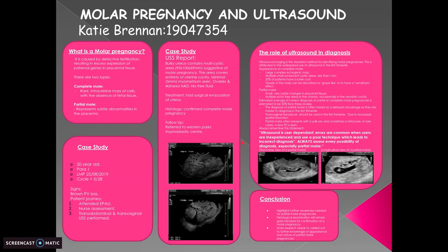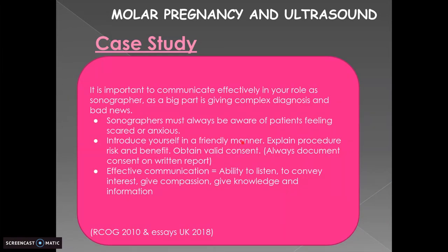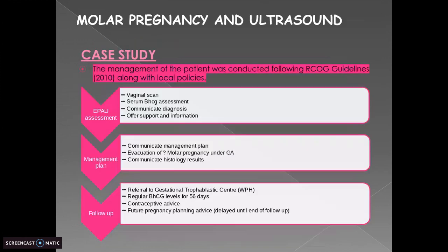The patient was given the diagnosis by the sonographer. A sonographer has the ability to give bad news in a way which is empathetic to the patient, whilst giving the facts of the findings, not using jargon that may confuse the patient. A nursing journal in 2018 described effective communication as the ability to listen, to convey interest, to give compassion, give knowledge and information. The patient consented to a surgical evacuation of the uterus to remove the molar pregnancy.